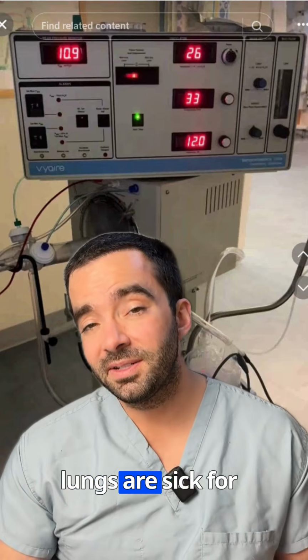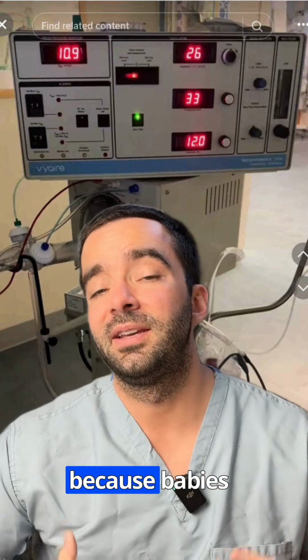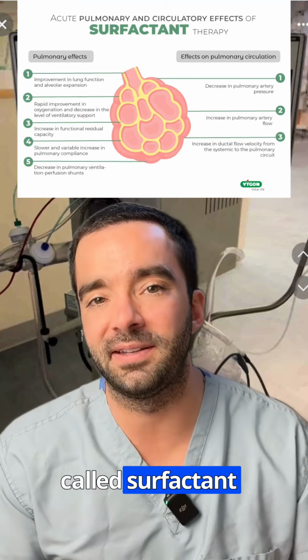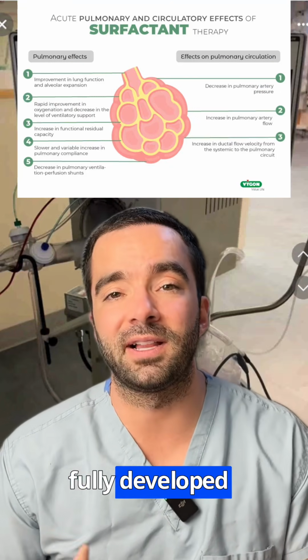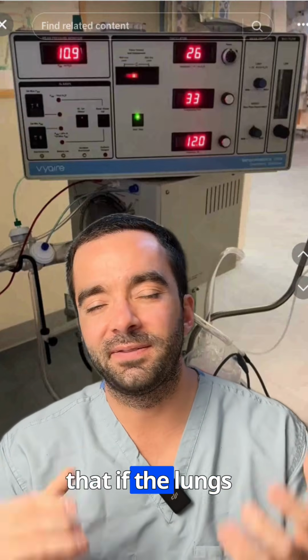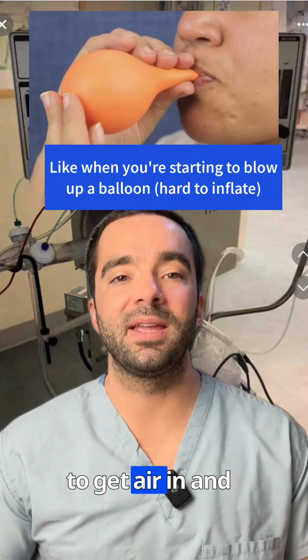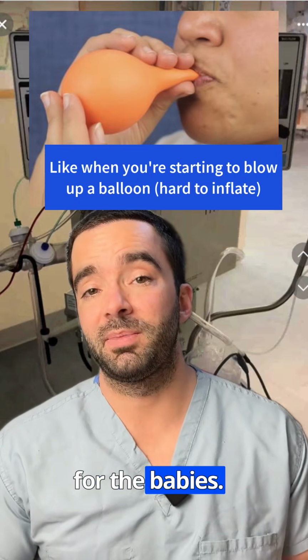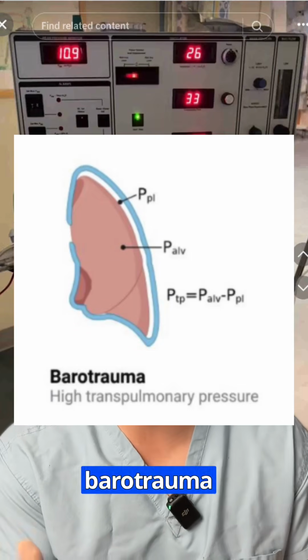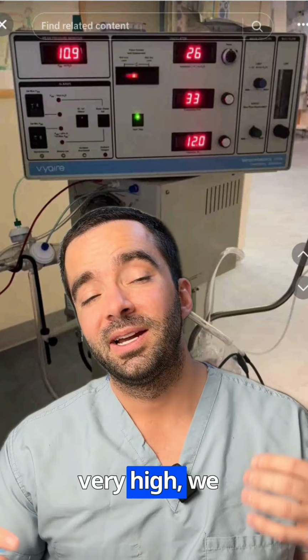But when the lungs are sick for whatever reason, so in the neonatal intensive care unit, it's usually because babies are born premature and they didn't have enough of something called surfactant on their lungs. So they haven't fully developed and it makes the lungs very stiff. You can imagine that if the lungs are really stiff, we have to use more pressure to get air in and out to breathe for the babies. This pressure can actually damage the lungs. This is called barotrauma.